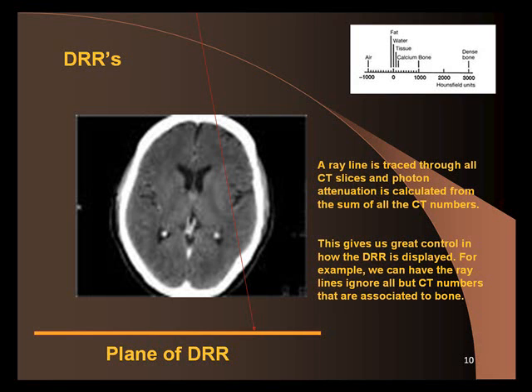Okay? It's a transmission of the patient's anatomy, and you're getting a radiograph, and the X-rays, actually the anode's over here. Anode. And you get a radiograph. Okay, and these X-rays come from the anode isotropically, right? They go in all directions, and they diverge in all directions, and they hit the film, and you end up with an X-ray that represents the attenuation of the patient.